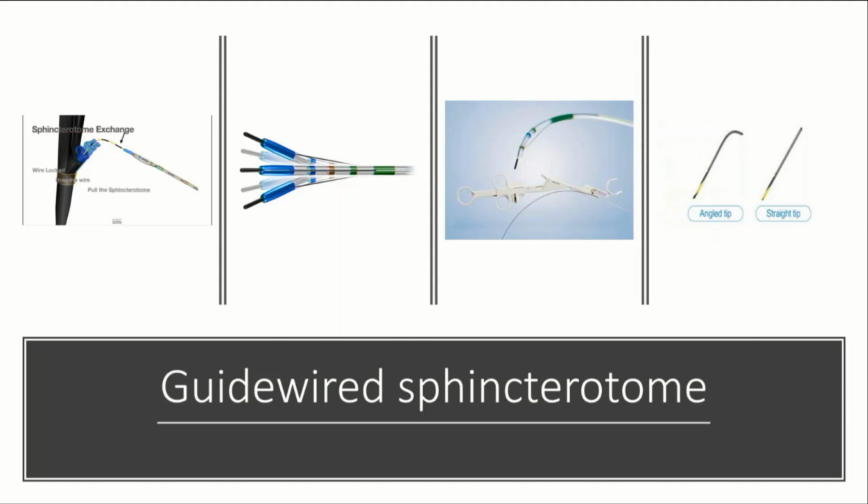Of course, we should not forget that the help of the nurse usually is of paramount importance, because in most departments, essentially, it's a combination between the nurse and the doctor. And of course, there are guide wires of various lengths, shorter or longer, depending on the preference and depending on whether the doctor himself wants to cannulate or with the help of the nurse.